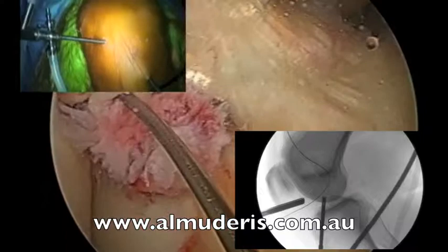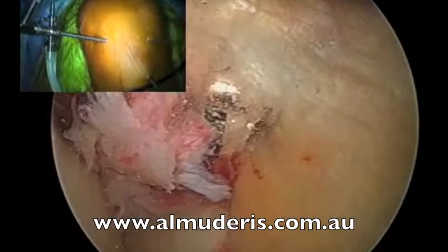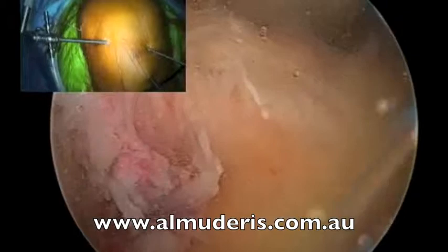We take the guide of the flip cutter and make sure that the flip cutter does not take the wire with it and does not damage the footprint of the ACL. Then the next step is we use the flip cutter on the tibia. X-ray. Then we unflip the flip cutter again and retrieve it out.